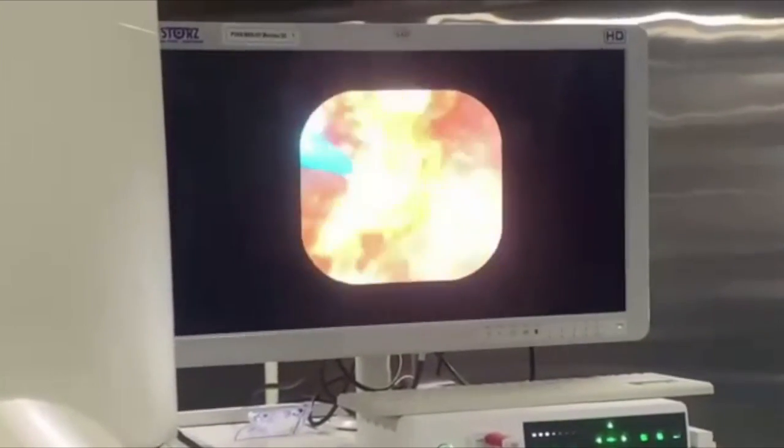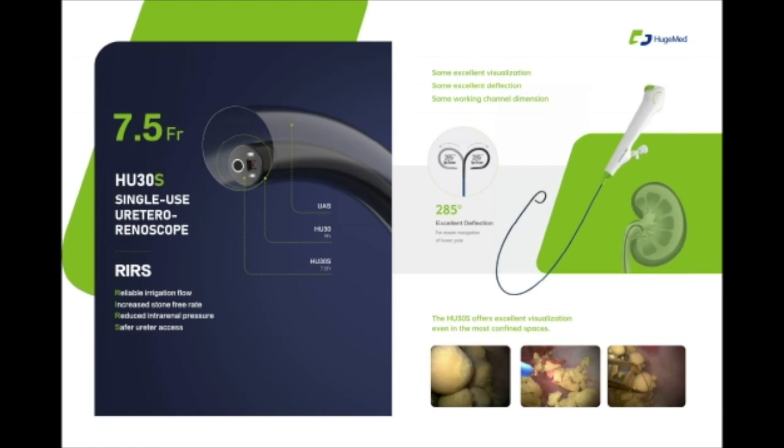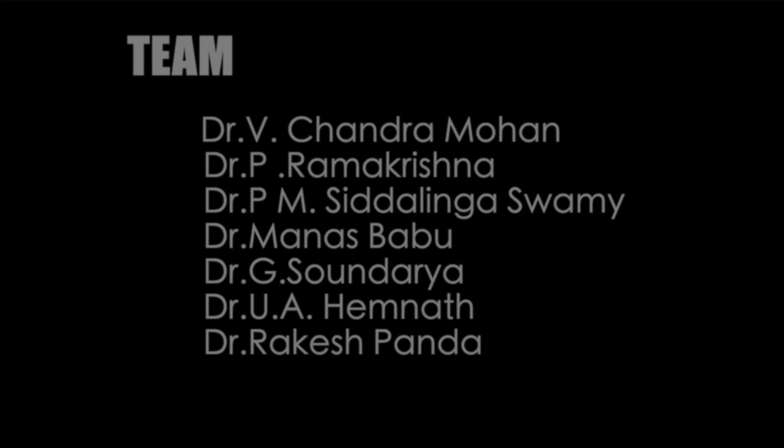The company is HugeMed. This is the first case I am seeing where such a small scope has been passed through a 9 by 11.5 access sheath. Thank you.